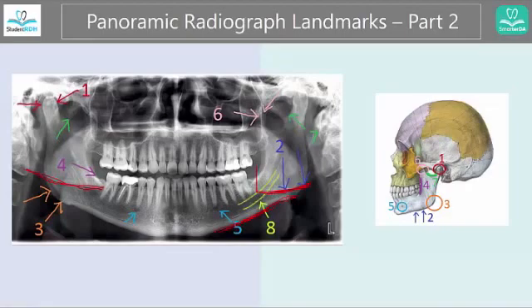Ghost image — we already studied it in terms of earrings, where you'll see blurry images higher up on the other side. But ghost image also applies to the spine and the mandible.